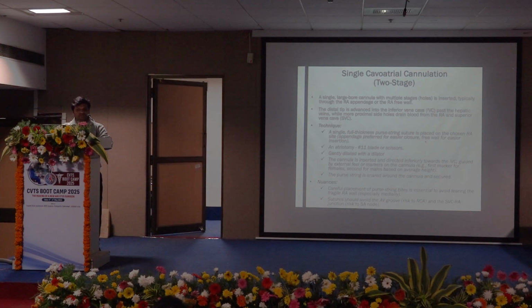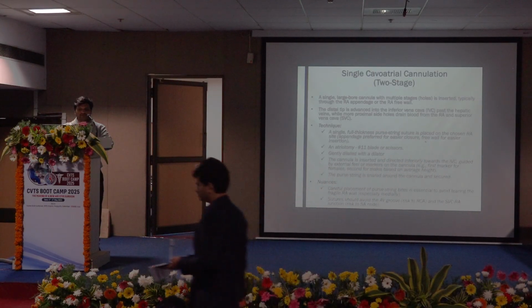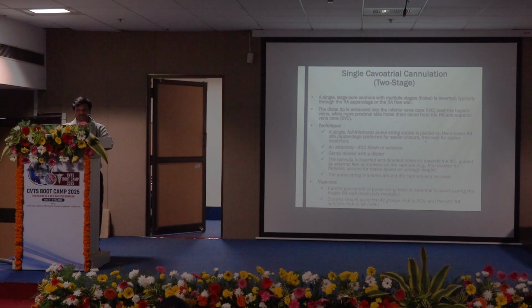Careful placement of the purse string bites is essential to avoid tearing the fragile RA wall, and the suture should avoid the AV groove because of the risk of RCA injury, and the SVC-RA junction because of the risk of SA nodal injury.